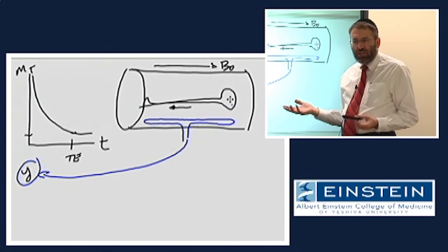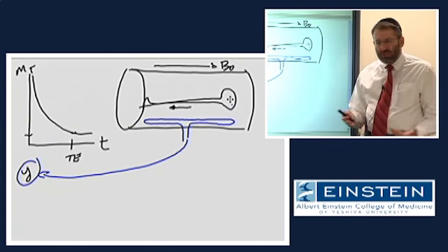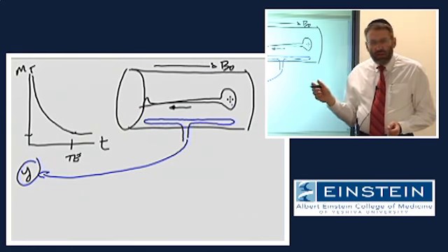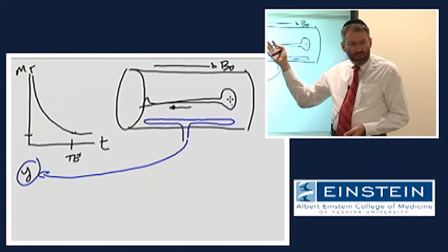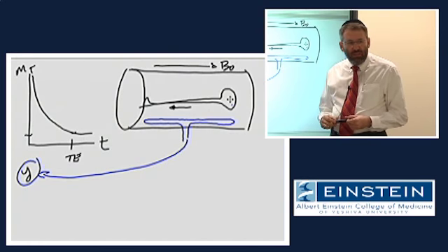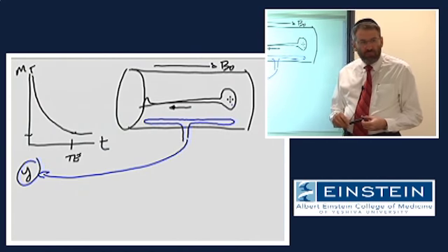It certainly doesn't allow us to make any assessment of the question we started out with yesterday. If you're looking at the liver and there's a tumor in the liver, how can you possibly distinguish them? Because this signal will be some average of everything. At most, if you had something bad going on that was a big enough component of the signal in that patient, you might be able to tell in general that there was something bad someplace in the body. But it wouldn't really give you much in the way of diagnostic information. So what we need to do is to generate an image.